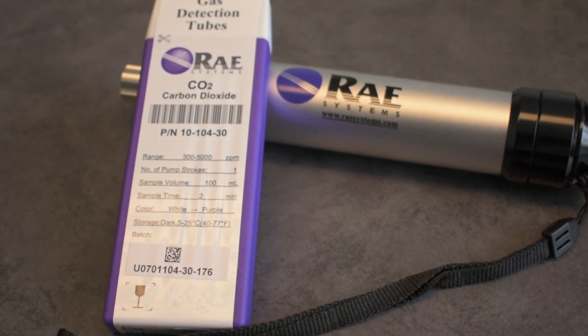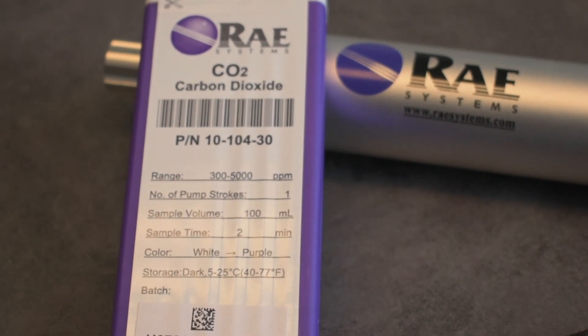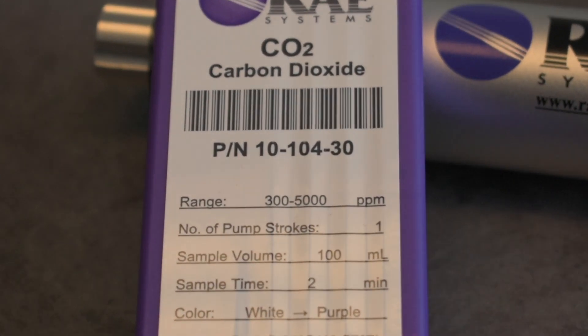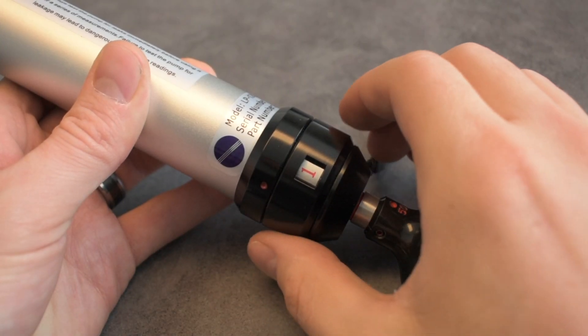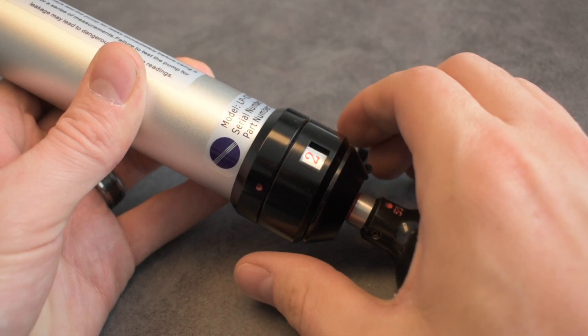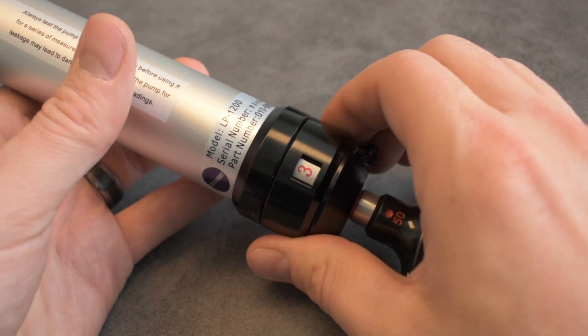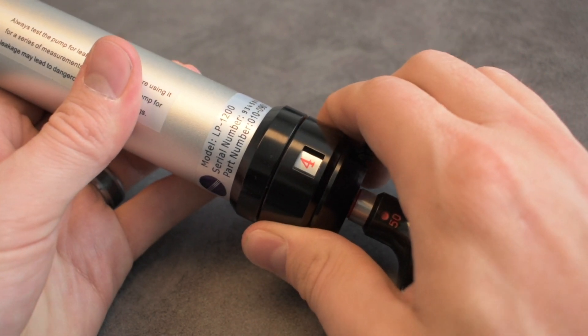Depending on the gas you're trying to sample and the range that you're looking for will determine the number of pump strokes. In this case, it says right on the package to use one full stroke and it will take two minutes to perform the sample. On this particular pump, there is a marker on the side of the pump body where you can set the counter to remind you how many pump strokes you need to take.